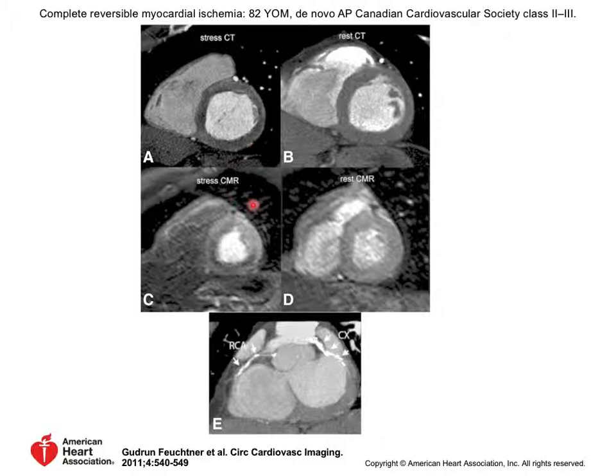So unfortunately, because on CT, all you're measuring is the relative absorption of X-rays. So the contrast concentration of the agent in CT, the difference between concentration between here and here isn't really that high. It isn't that high either in the MR. However, on the MR, what the contrast agent is doing is it's changing the T1 of the tissue, and so even a small change in concentration makes a fairly large change in that relaxation rate. And so it amplifies the effect.